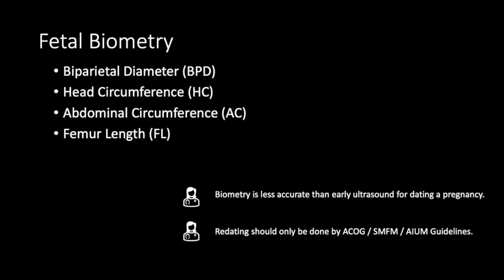Biometry is less accurate than early ultrasound for dating a pregnancy and gets less accurate the farther along in a pregnancy that we are. So redating should only be done according to the ACOG, Society of Maternal Fetal Medicine, and AIUM guidelines.